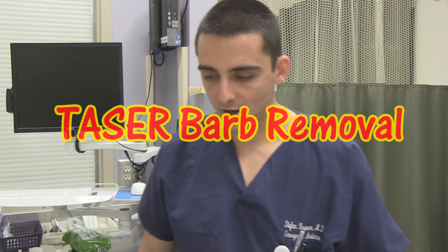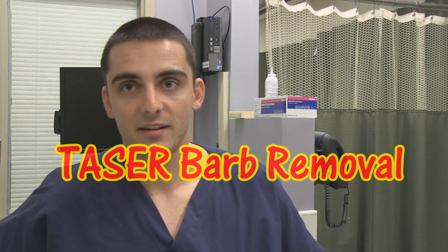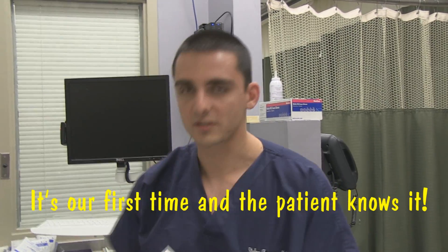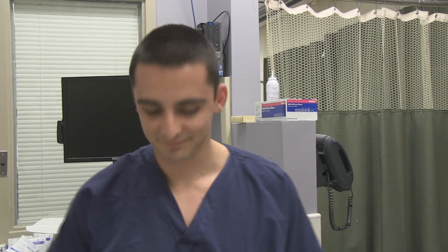So what are you going to be doing today? Basically we're going to be removing a barb out of the gentleman's back. He was tasered earlier today and now there's still just a single barb left. It's not too deep and we're thinking we can just pull it out fairly easily with the needle driver and some firm counter pressure. Sounds good.